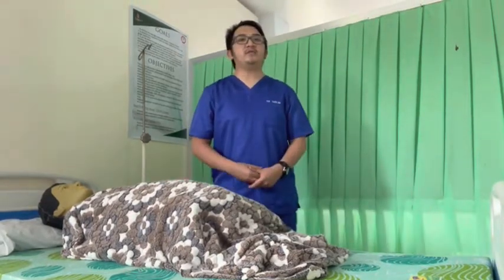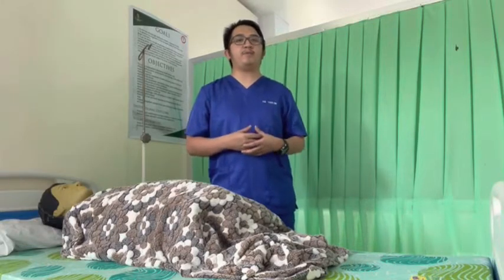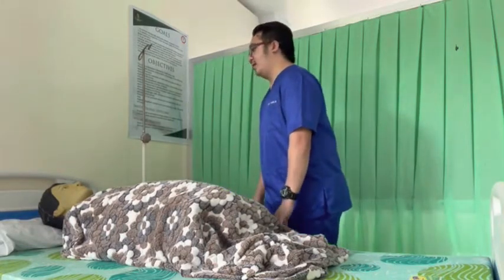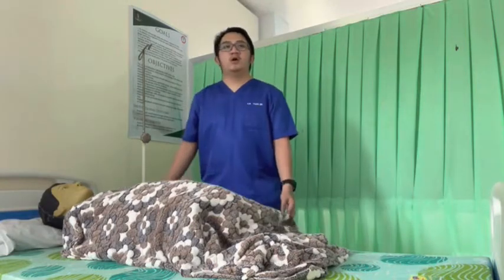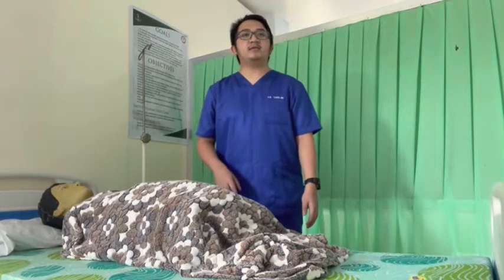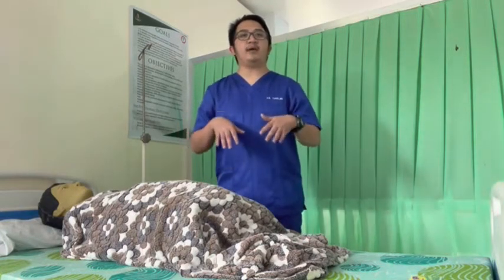Instruct the patient to void before the procedure to promote comfort during the procedure. So, sir, can you void? Cannot. Okay.